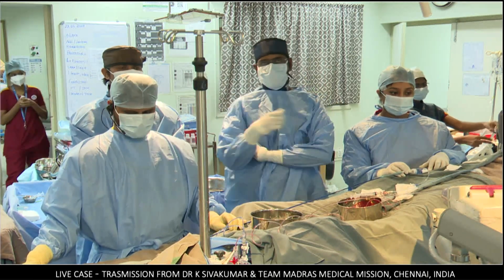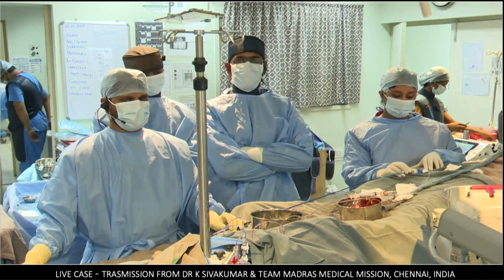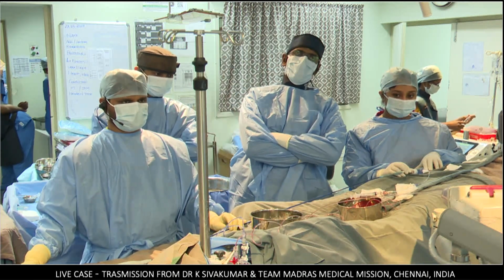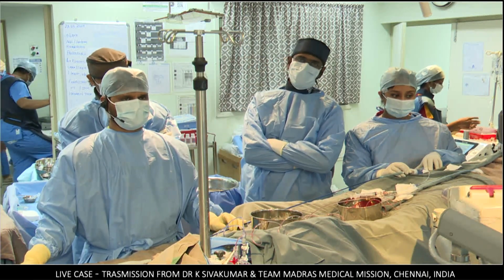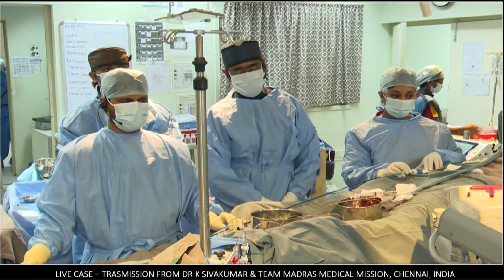Dr. Pramod, who is my colleague here, is the person who did the virtual reality reconstructions on the Vimencio platform. He basically dissects out the heart. He discusses a lot with Adam Kolesnik from Poland, and he gets the virtual valve implantation.